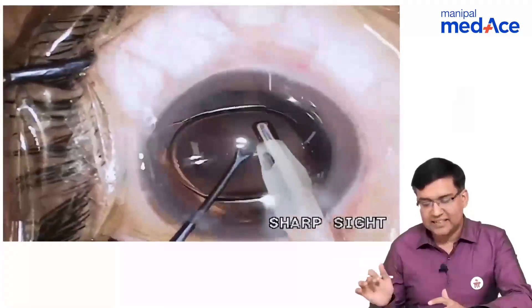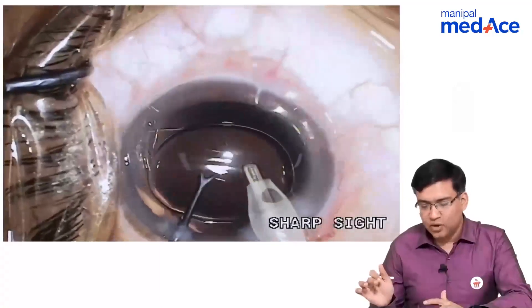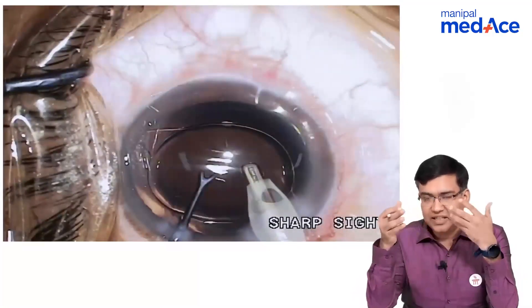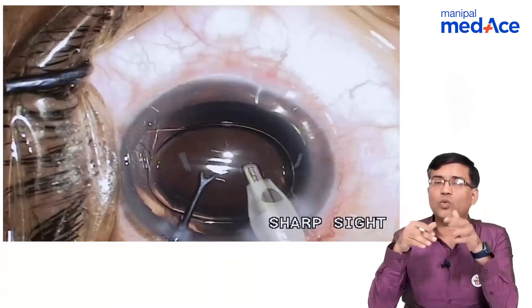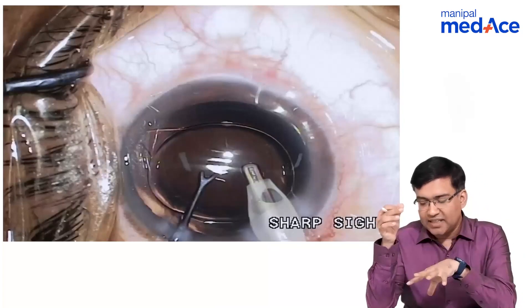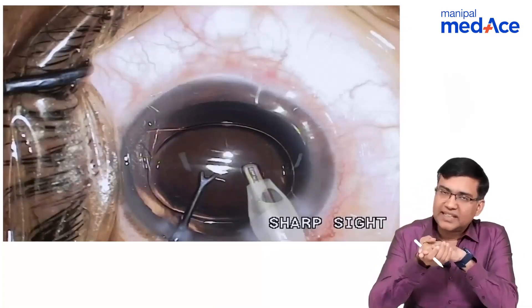This is the cataract surgery being done in a patient and these are the major steps. They can give a picture of any step or a video and ask what step is being done. That is why it is important that you remember the various steps of the cataract surgery.